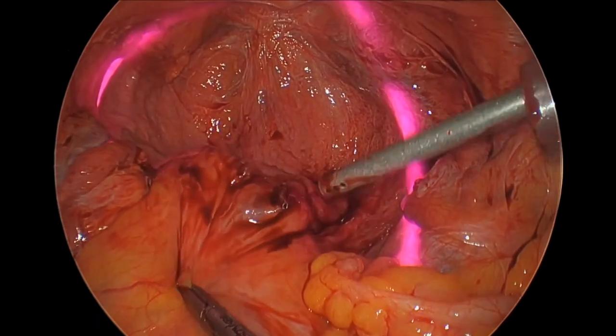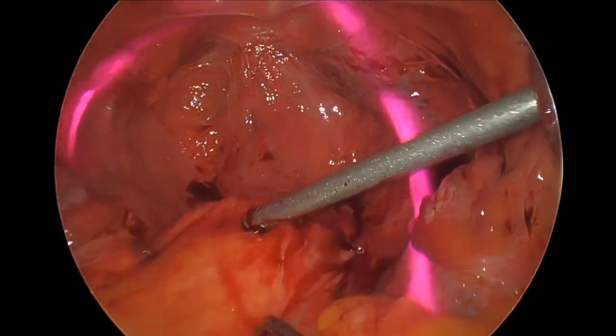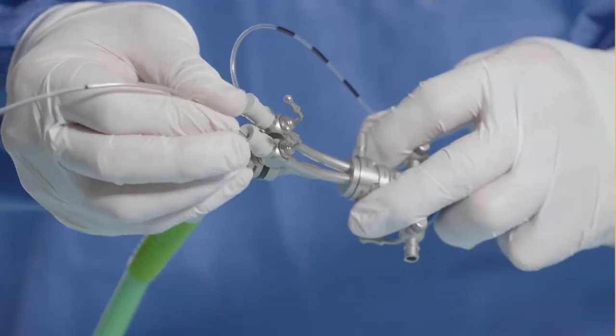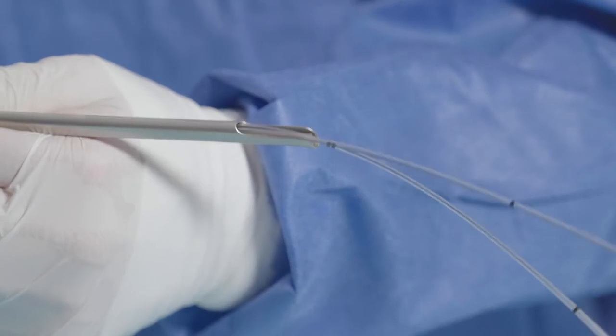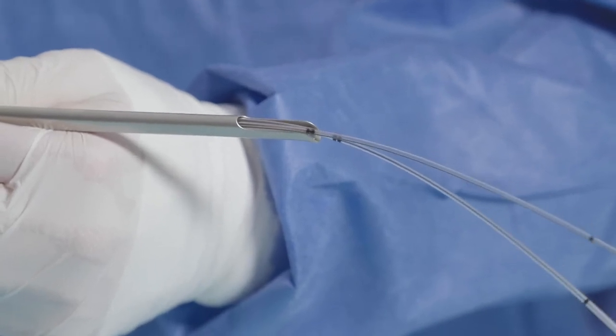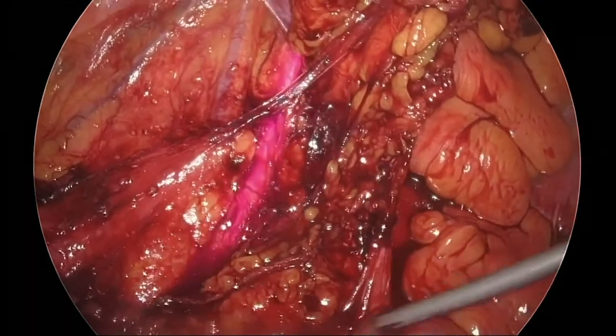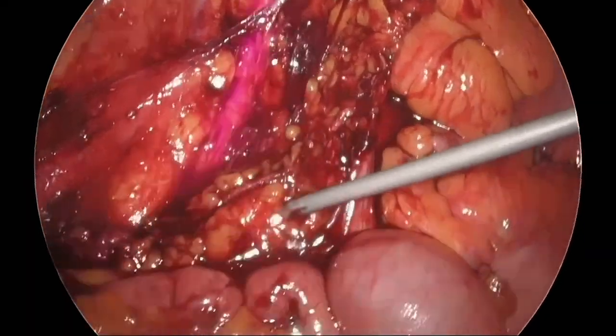The Stryker Iris ureteral kit helps with visual identification of the ureters during lower pelvic surgery. The catheters and emitting fibers are placed via cystoscopy prior to a surgical procedure. During the procedure, Stryker's endoscopic cameras can detect the light emitted from the fibers showing the ureter.